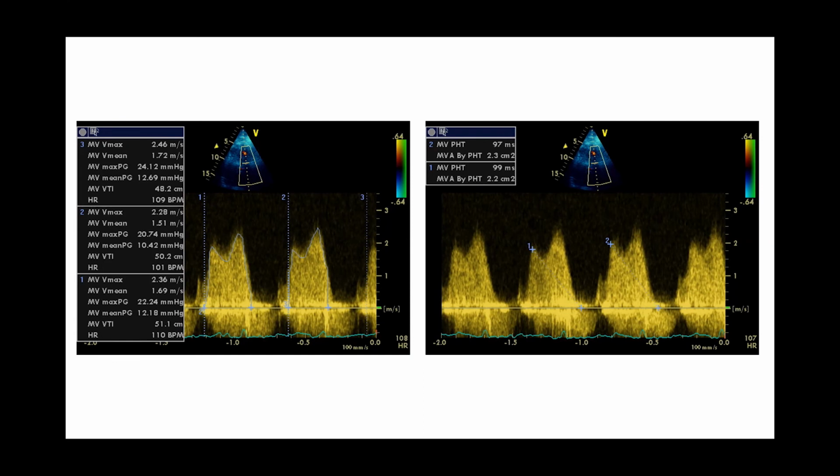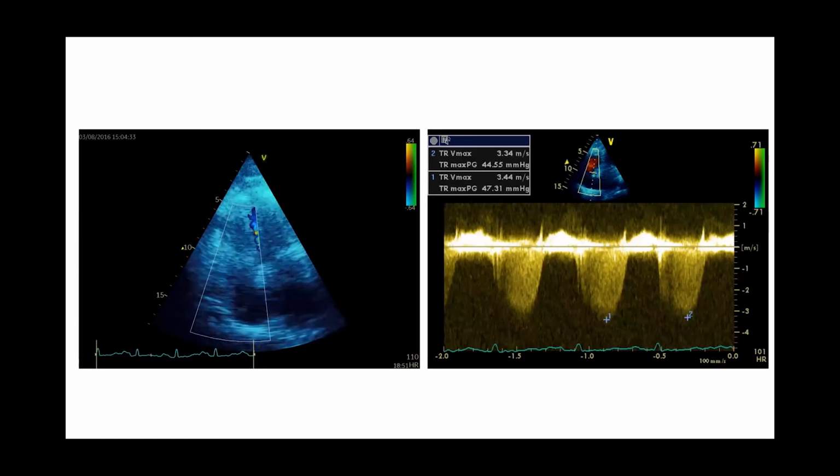Discordance here, and off the history of CREST, she's going to have pulmonary hypertension. Well, probably going to have pulmonary hypertension anyway. So I suspect the next screen, which will have the Doppler through the tricuspid valve, will show quite elevated pulmonary pressures. Oh, that's not too bad.